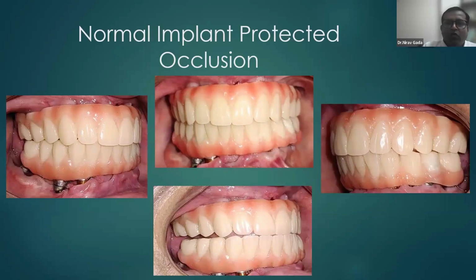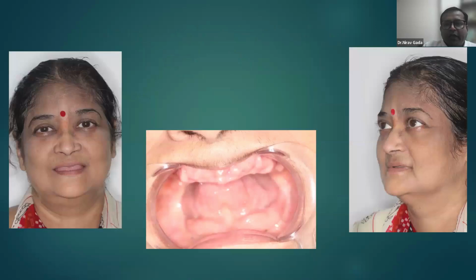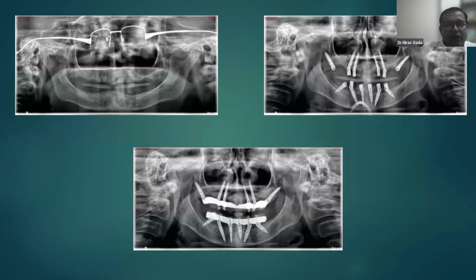Now I would like to show you a few cases which we have done and how we have gone ahead. This is actually a very simple case, where the patient is completely edentulous, and as we see, we have a very good amount of bone in the anterior zone, in the lowers and the upper area. Still, what we have done here in the maxilla again is engagement of the nasal corticals and also respected the alveolar bone, and we have engaged the pterygoids, and in the lowers again in the interforaminal area. And once we connect the multi units, this is the final prosthesis in the picture.